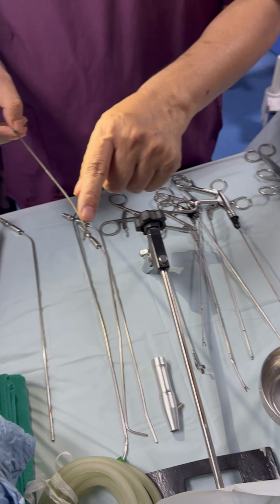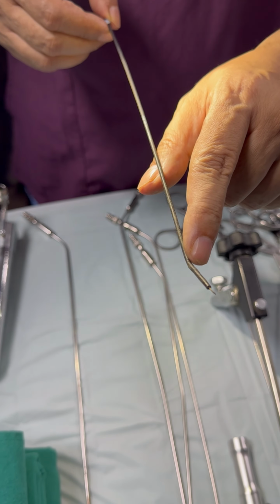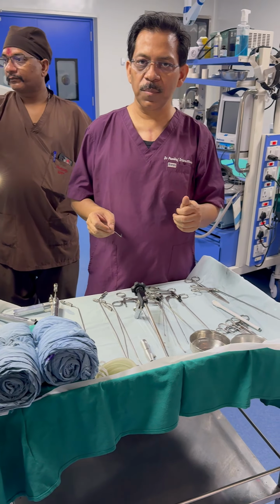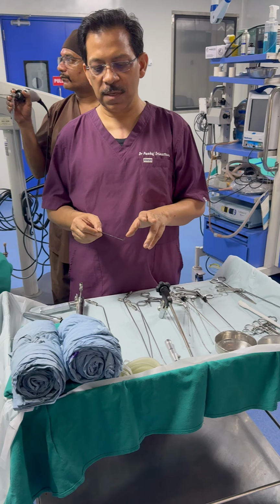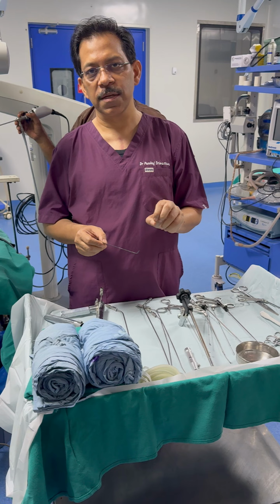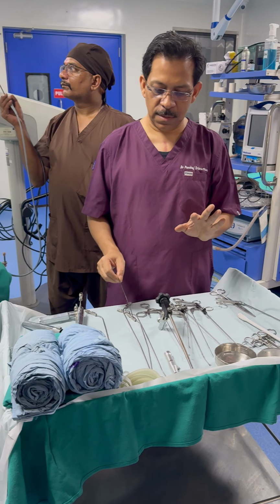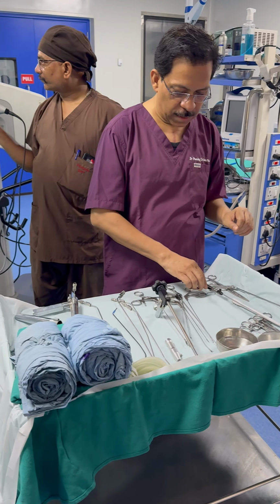Then we have a tilted radio frequency tip for taking biopsy and operating. That is important. So in lesions like polyp or hemangioma or things like that, when we do it by cold instruments, that is not enough, because if the base is there, we will have a recurrence. So we will have to cauterize this either by laser or by radio frequency, so that the voice quality is not disturbed and the lesion is not recurrent.